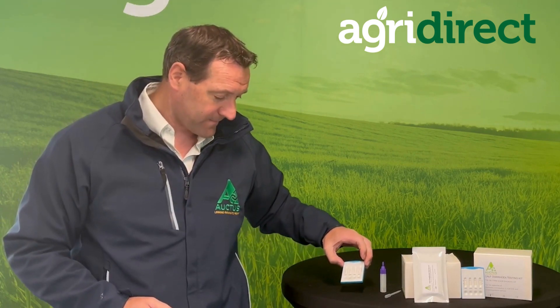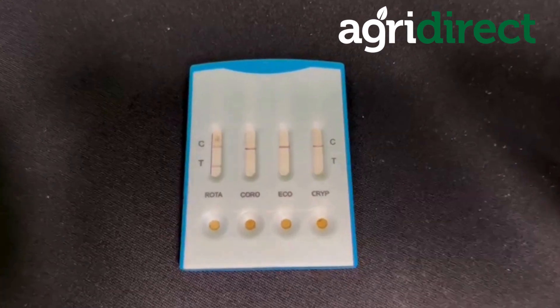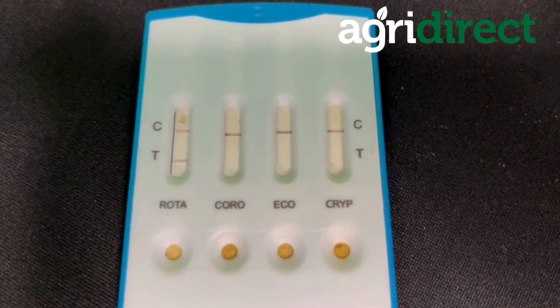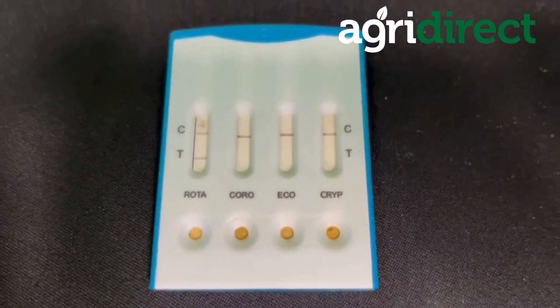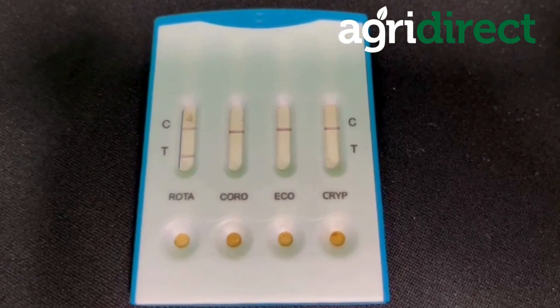We leave the cassette on a flat surface for 10 minutes and the sample will work its way up through each of the wells. Then we see we have a C line, which is the control line, and on this particular example here, we see where the four lines have gone red, which basically indicates that the test is working.